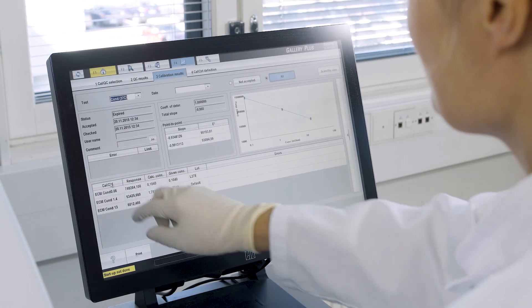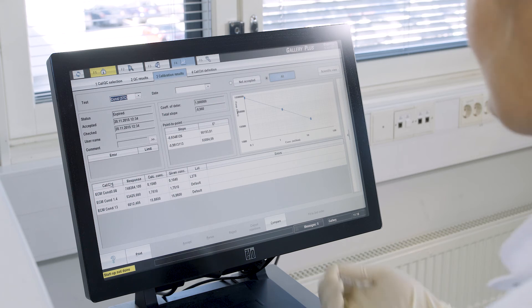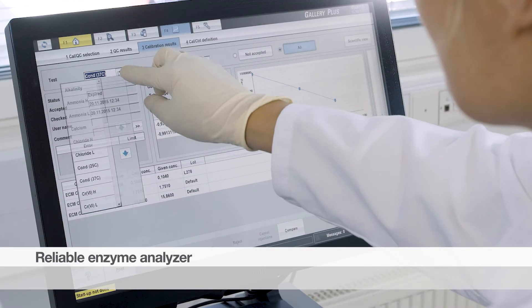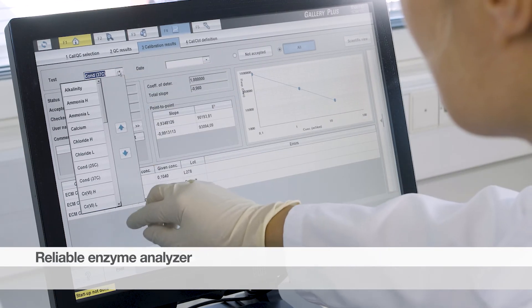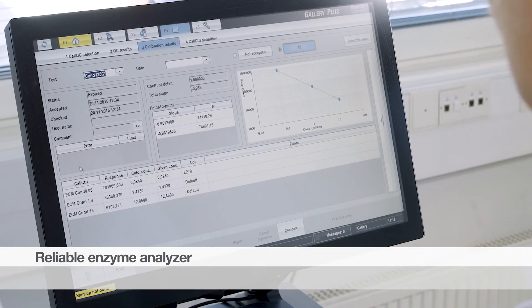However, results can be reported at different reference temperatures using the built-in software functionality. Multi-point pH and conductivity calibration covering a wider range assures precise, accurate, and reliable results.